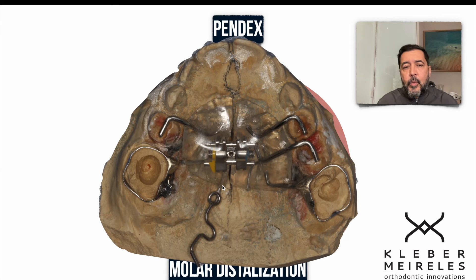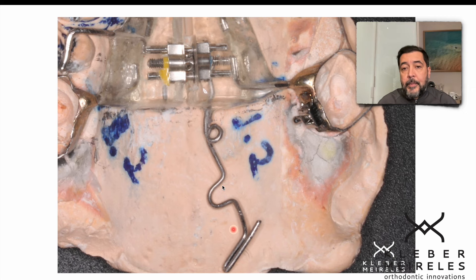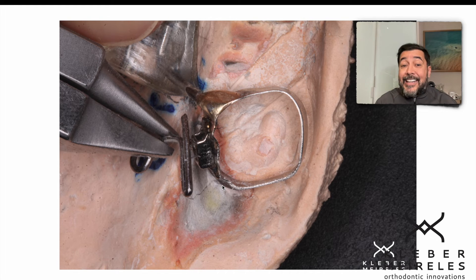Here is how we do it. We do the activation of the loop. This is a TMA 0.032 inches wire. We place it parallel to the maxillary suture and then do the installation — inserting the loop inside the tube. There are details that can help: the pre-activation in first and second order of the tip that is going to be inserted into the tube. When I do this activation, I lose approximately 30% of activation because of permanent deformation of the wire. So I do a pre-activation in first order.